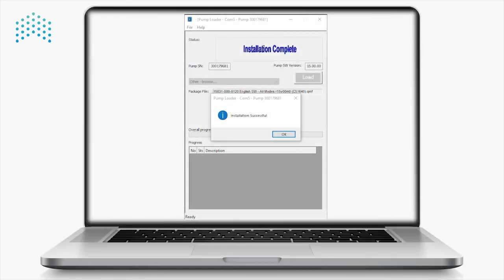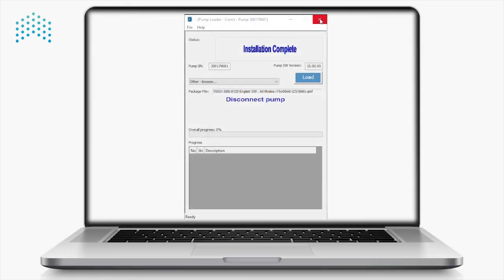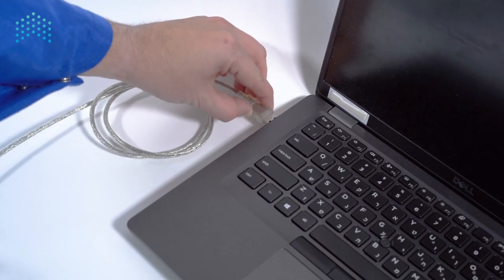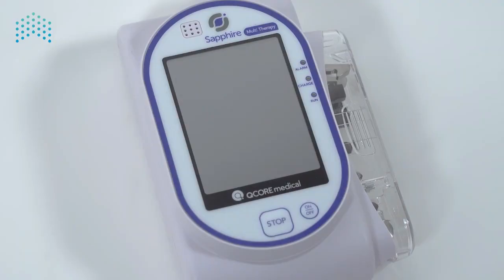After the update has completed, press OK on the computer and close the pump loader. Disconnect the pump from the computer and wait for the pump's startup screen to reappear.